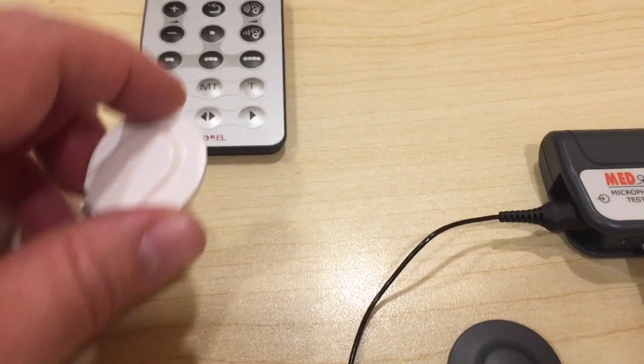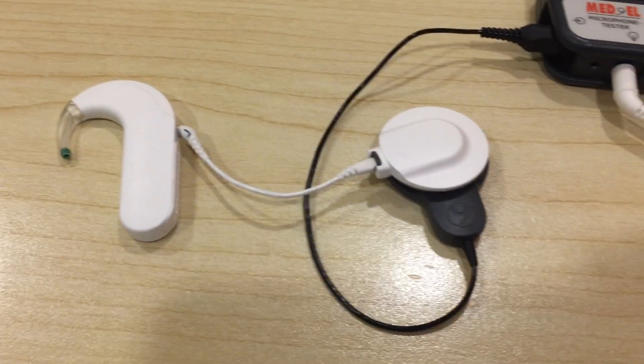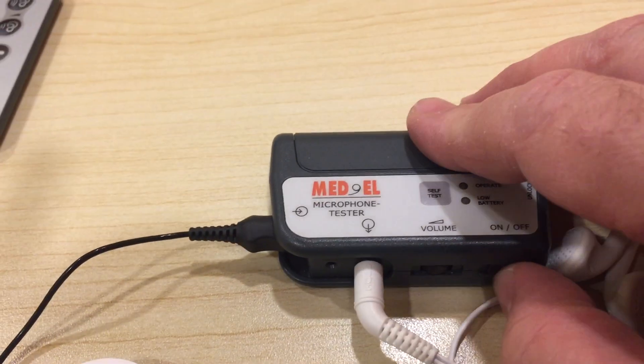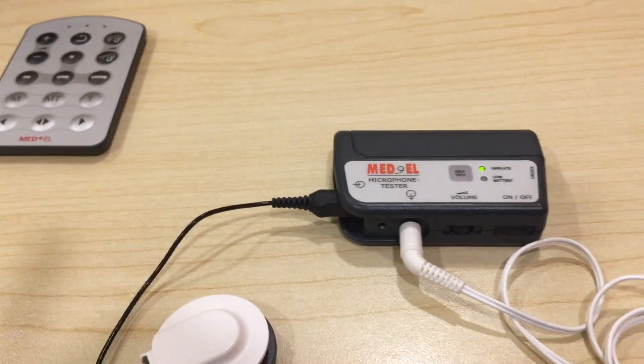Next, take the coil and place it over the cable. Make sure that your microphone test device is powered on and that you're listening to the earbuds.